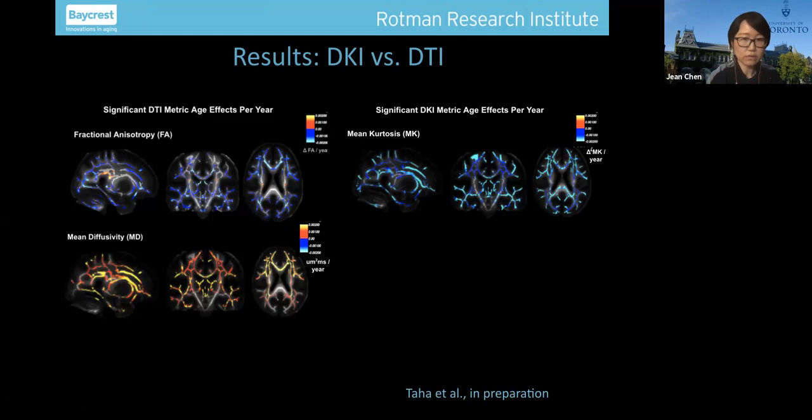So these are still all here. And more to that, you can still see in the posterior inferior region, there's a lack of MD effects. On the right hand, you see the mean kurtosis effects, and basically everything is going down, everything is blue. So we see while kurtosis does go down in this region, diffusivity does not.